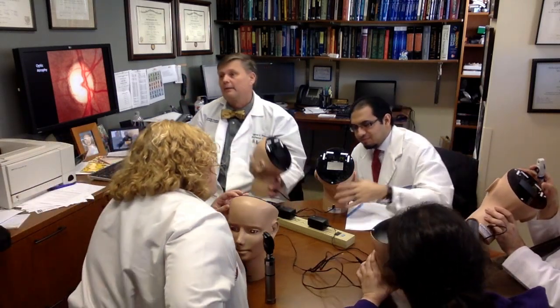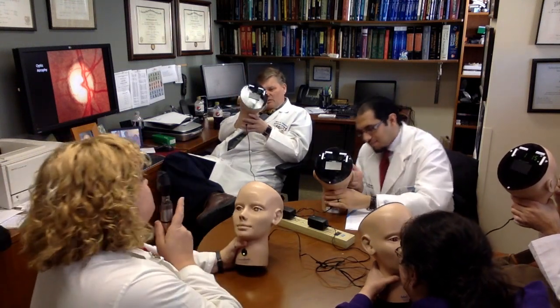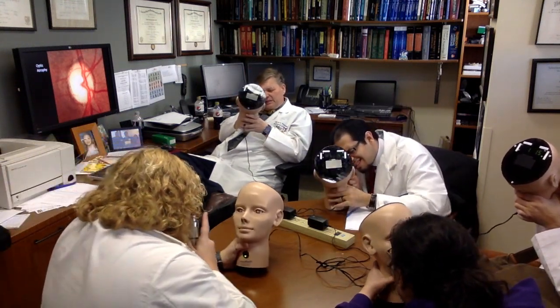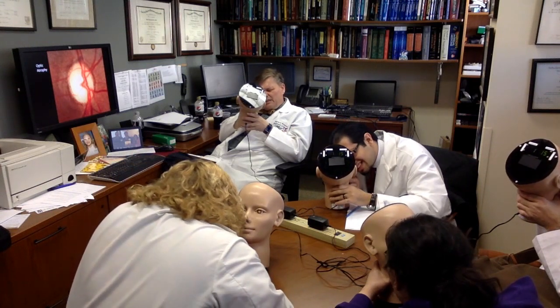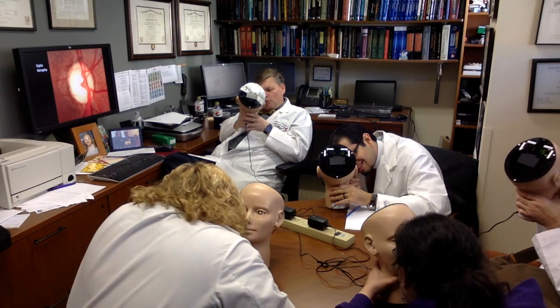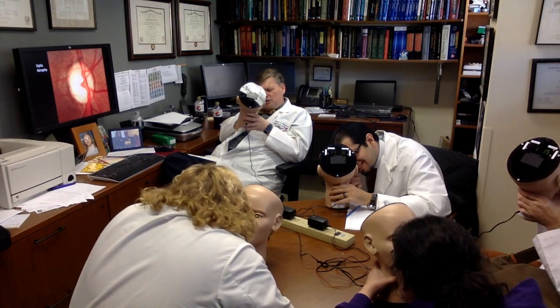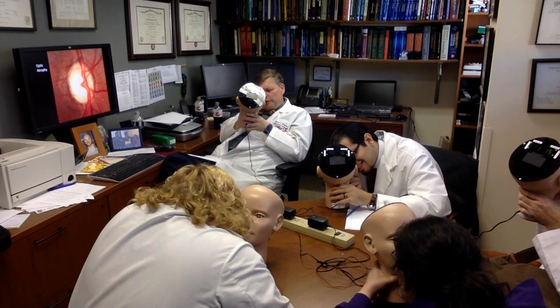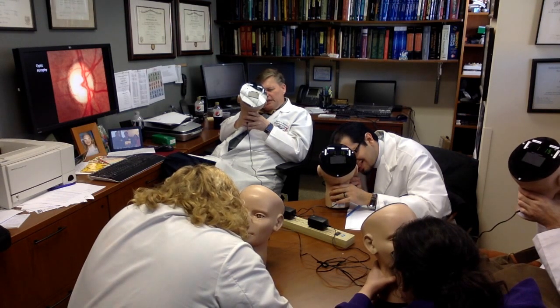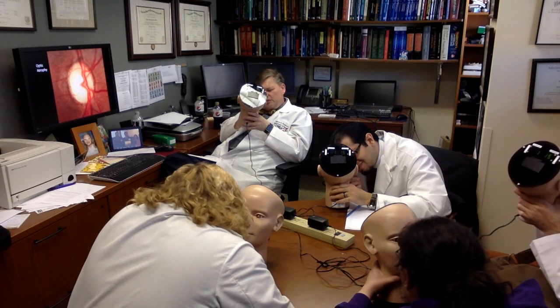15. Okay, and let's focus in the distance. And now let's come in at 15 degrees to get closer, closer, closer. And then focus in. Oh. You think it's normal or abnormal? Abnormal. Okay, can you make out where the disc should be? Yes, well, where it should be. Do you see any margins of the disc? No. No margins. The vessels are tortuous.